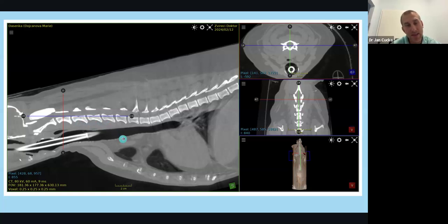On this scan, I'm not really sure that there is anything wrong. But from the clinical and neuro examination, we know there was a high possibility of neck disease caused by mechanical problems. So we were looking for some disc material in the spine.